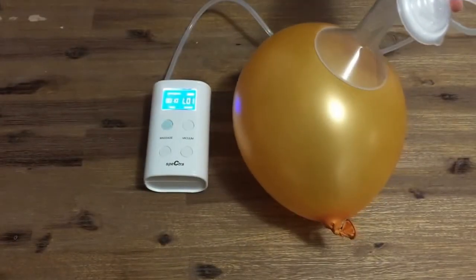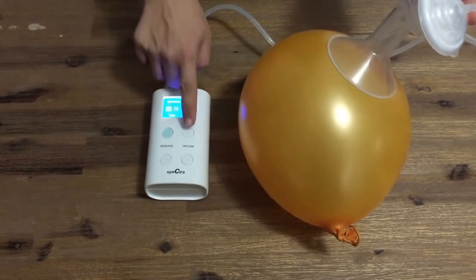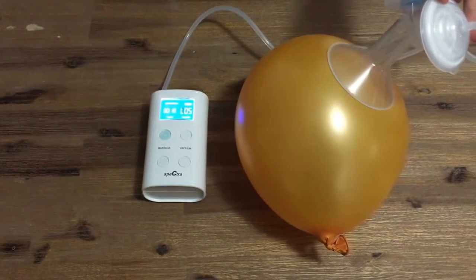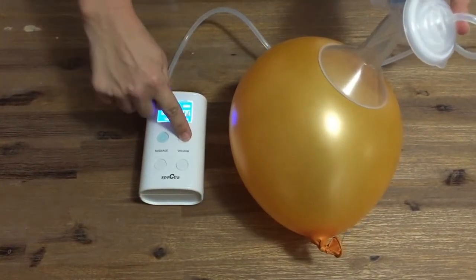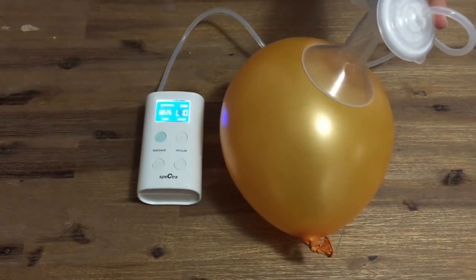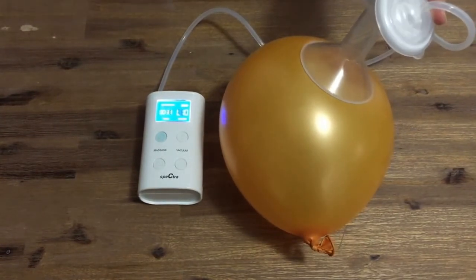And finally here is the Spectra 9+ at suction level 1, halfway at level 5, and at maximum suction level 10. Again, noticing that the cycle speed is slowing as I increase the suction.